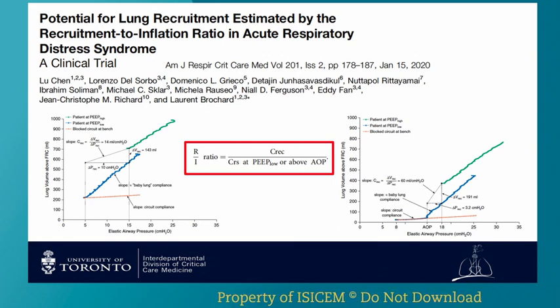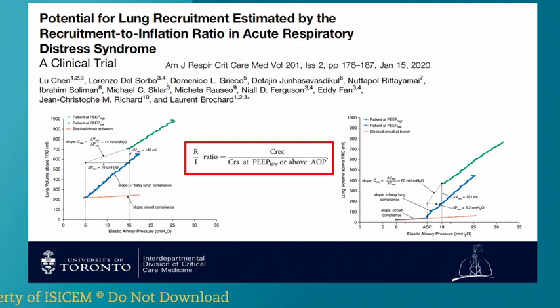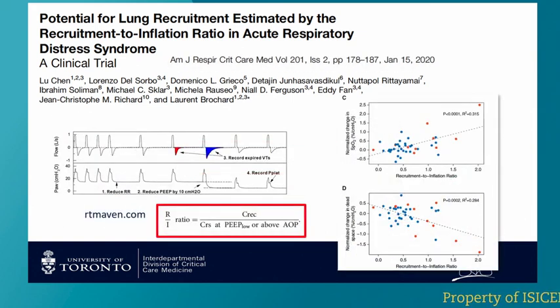And this slope here is the slope of the respiratory circuit with the airway occluded. So this is an example of airway closure with subsequent airway opening with pressure, that looks to happen in up to a quarter or a third of patients with ARDS, more in patients who are morbidly obese.